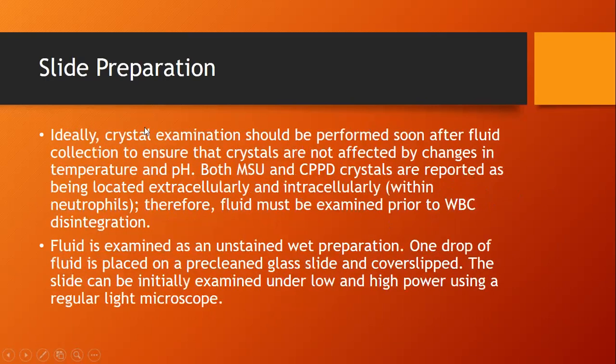So how do we prepare the slide for crystal examination or identification? This is performed immediately after the fluid is collected to ensure that the crystals do not disintegrate, because crystals are affected by changes in temperature and pH.